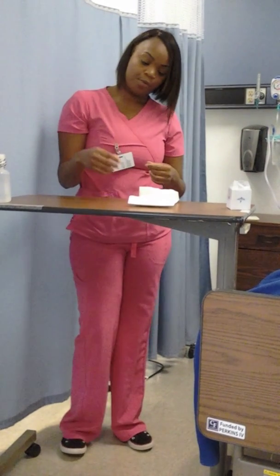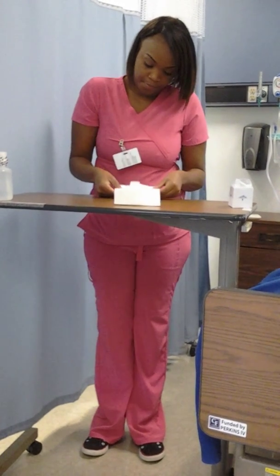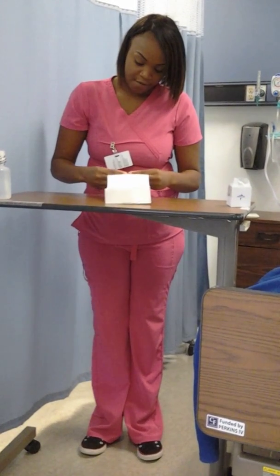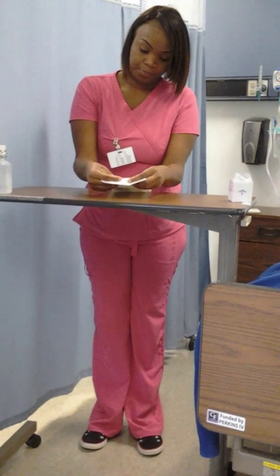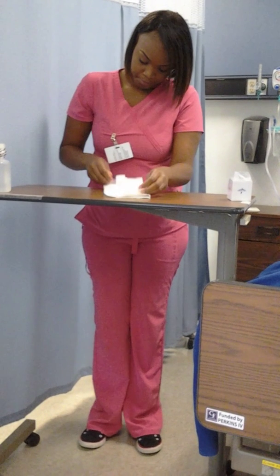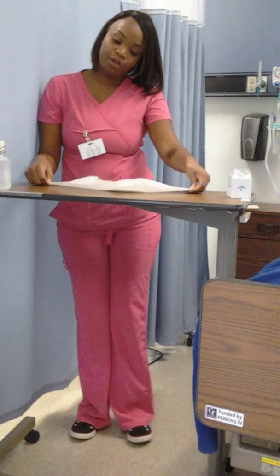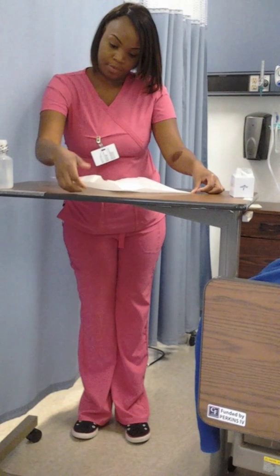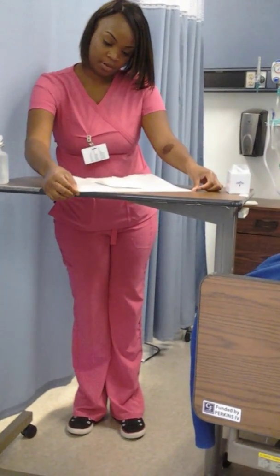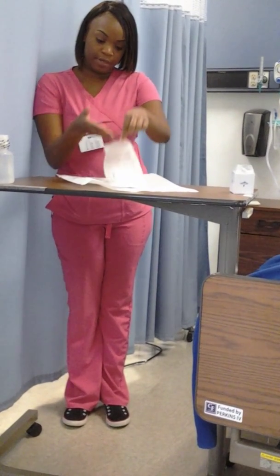I'm going to go ahead and open up my equipment. Set up my sterile field now. I'm going to take these and kind of fold them back. Now you do have a 1-inch border on your sterile field. I'm going to go ahead and don my sterile gloves. Take the first one. I'm going to step back.